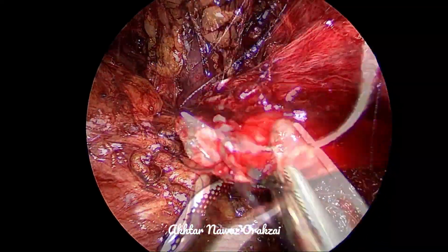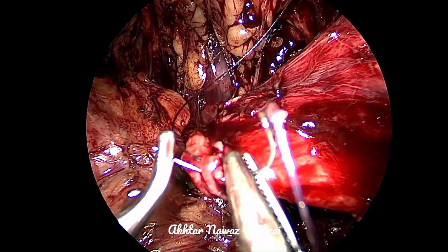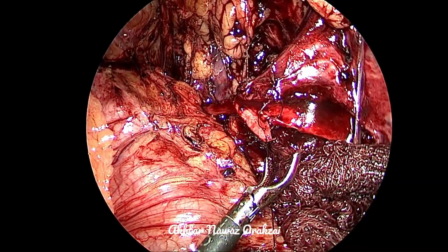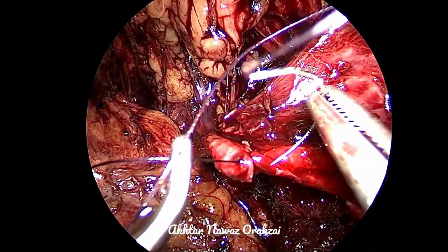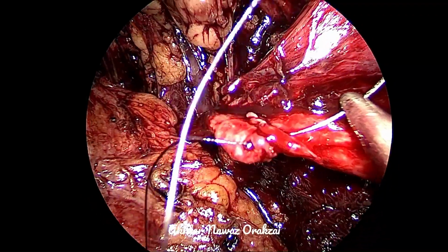Then the anastomosis has to be in the dependent area, because if it's not in the dependent area, then there is again a chance of PUJ obstruction and failure of the procedure. Then the anastomosis has to be tension free.